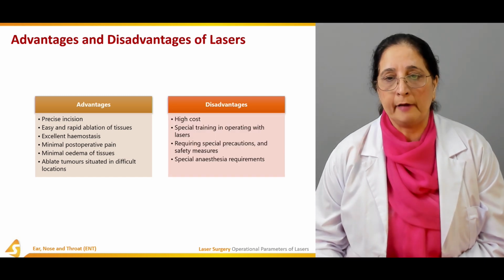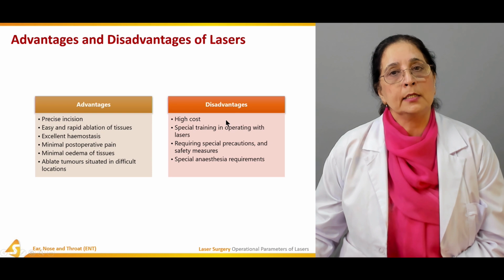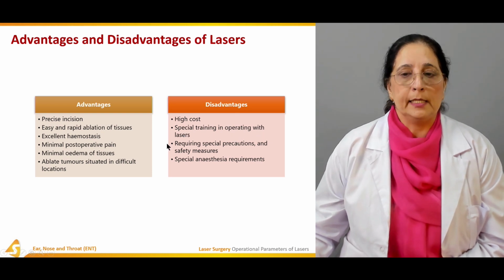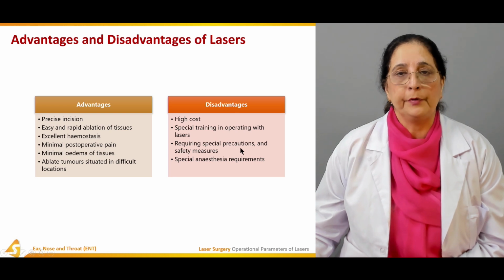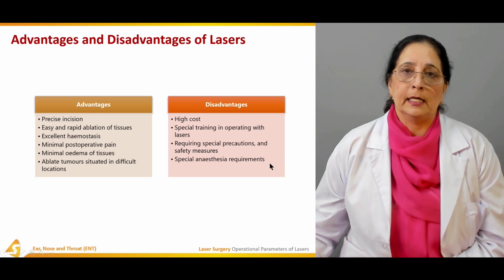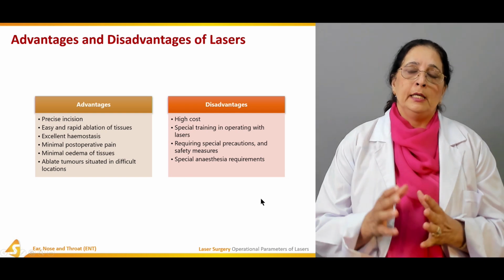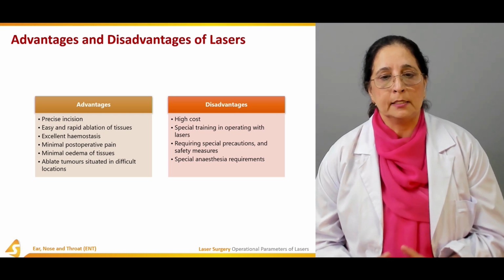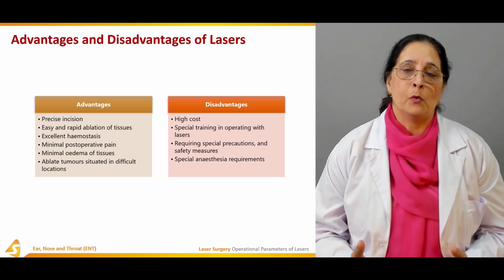Now some disadvantages are: the cost is high, special training is required, operating with lasers requires special precautions and safety measures, and there is a special anesthesia requirement. So there are some advantages and some disadvantages, but the advantages are more.